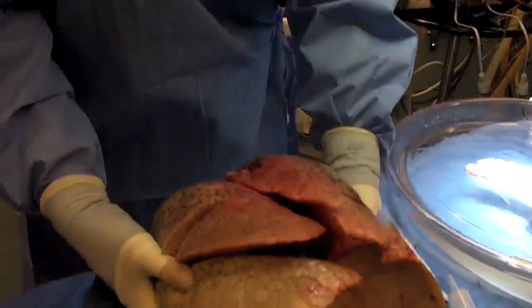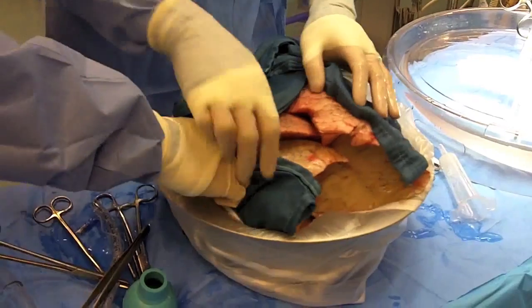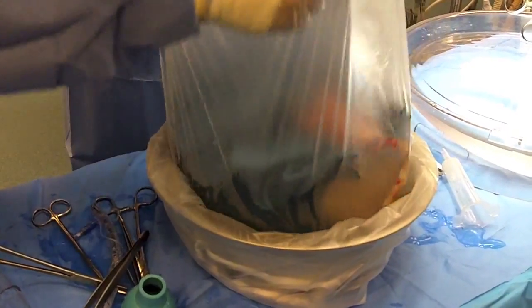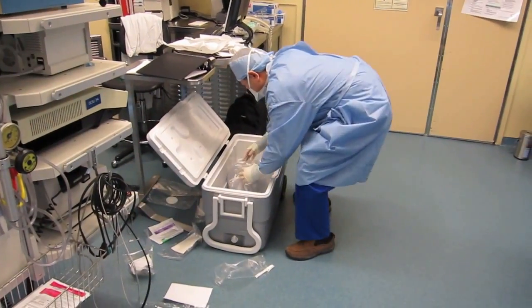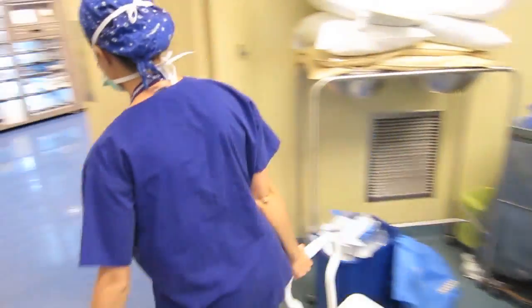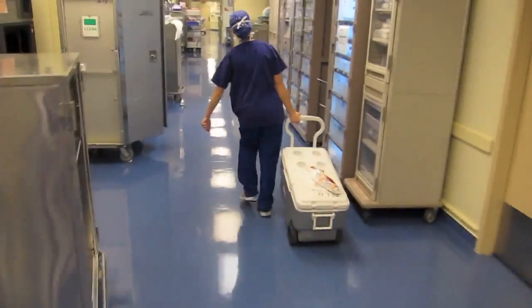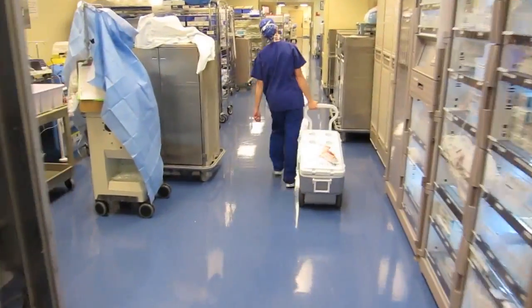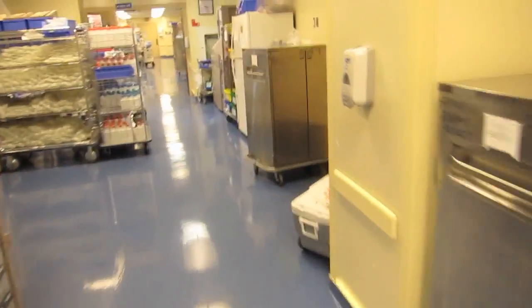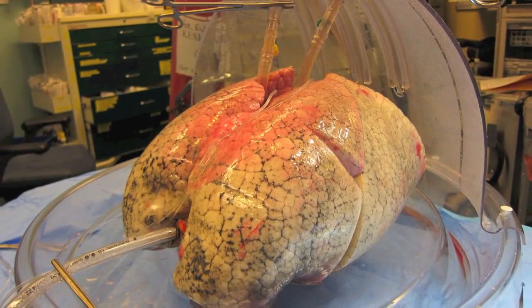The most important thing is if you look at utilization of donor lungs worldwide, only 15% of donor lungs on average are used. And the reason is that the other lungs, while they might be good, we can't be sure that they're good and safe to use. So the first major impact of the ex vivo system is some of those lungs that are good but we just can't tell, it will allow us to assess it. Ultimately, I think that having a lung that is better prepared for the transplant process will mean that we will have organs that will last longer and have our recipients live longer after transplantation.